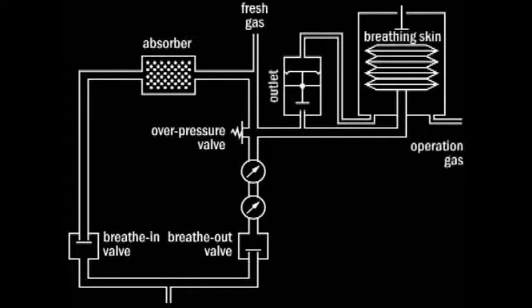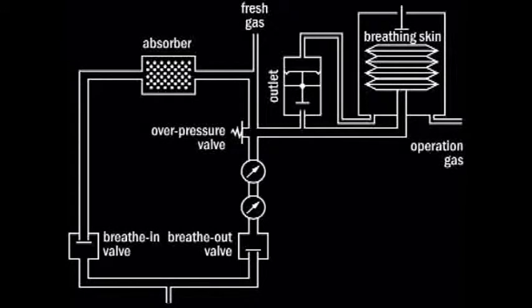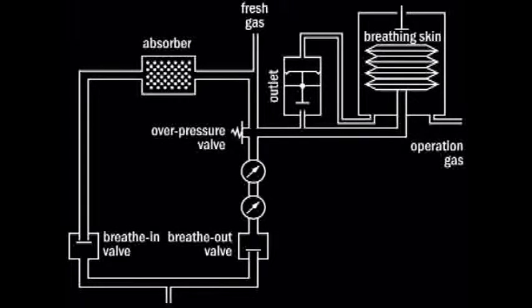One of the applications is the use of assisted respiration, with the possibility to select between an expiratory end respiration pressure of 0 millibar, abbreviated ZEEP, or a positive or negative expiratory end respiration pressure, abbreviated PEEP, respective NEEP.